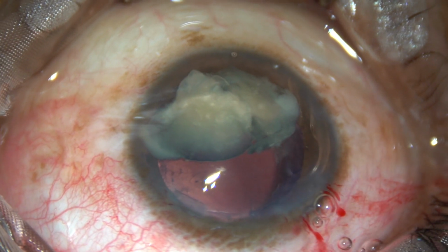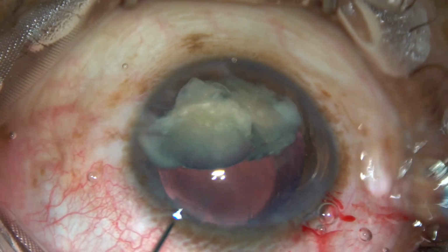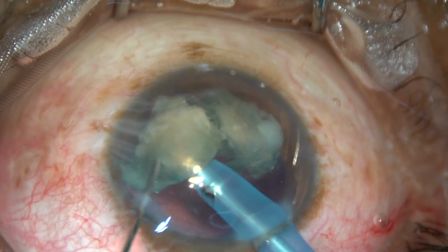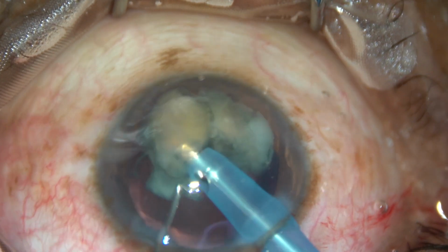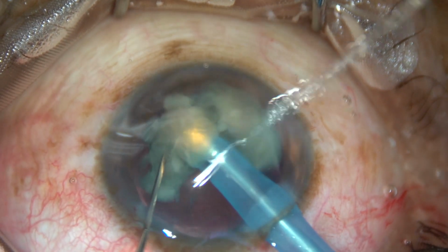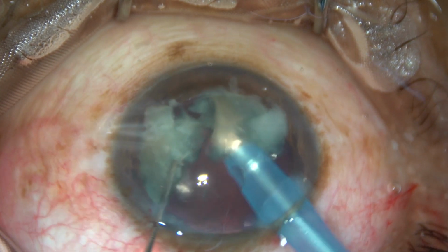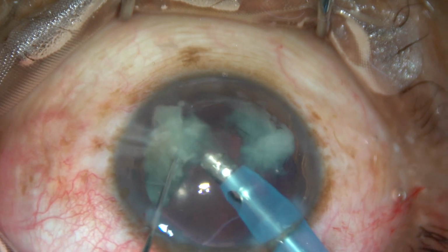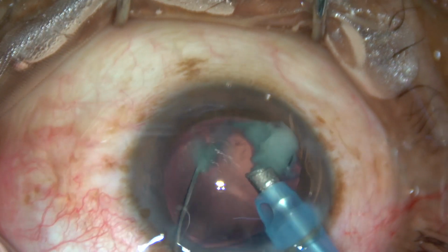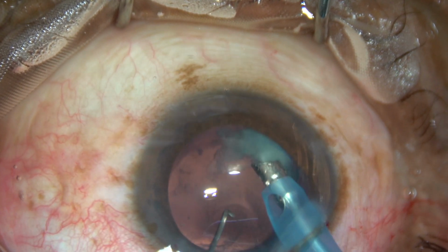We must be very cautious at this time. We must keep a small gap between the intraocular lens and the phaco handpiece, and we should be quite far away from the corneal endothelium. So we should be at the central zone where the anterior chamber depth is maximum. So slowly and very gently I am emulsifying the nuclear pieces.